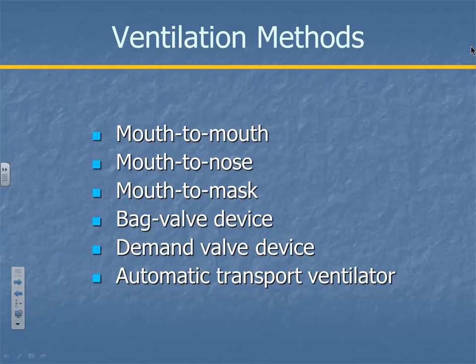So, anyway. Methods of ventilating. We don't do mouth to mouth, do we? In the olden days we used to do mouth to nose on pediatric patients. Is that gross? Have you ever seen a kid that doesn't have a snotty nose? Anyway, mouth to mask. For those of you that had me before, you should remember this.